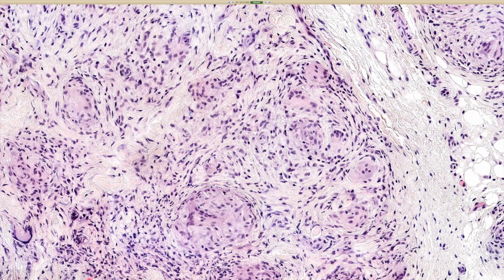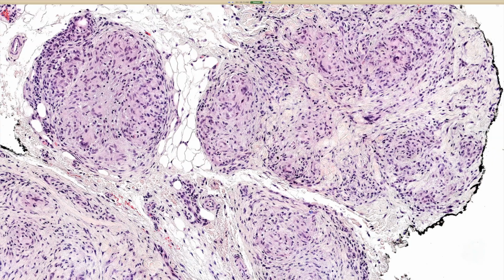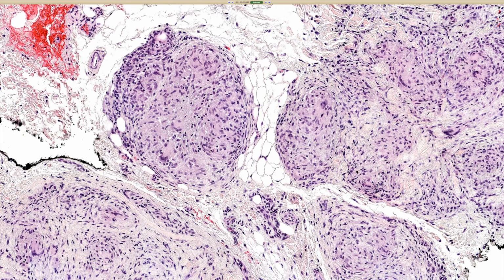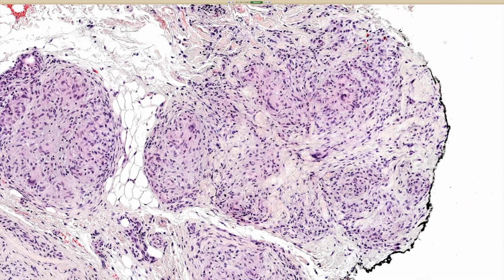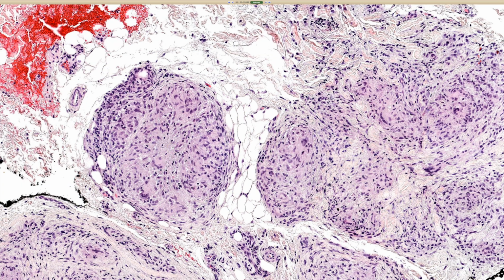In real life, this is a diagnosis of exclusion, and we must exclude other things. I've definitely seen great sarcoidal granulomas in the setting of foreign body reaction. I've also seen sarcoidal granulomas in the setting of mycobacterial infection, right? Unfortunately, the kinds of mycobacterial infection where you get the nice sarcoidal granulomas are usually the ones where the patients have good cell-mediated immunity and they kill off most of the organisms. So the organisms are very rare and hard to find, which is frustrating.